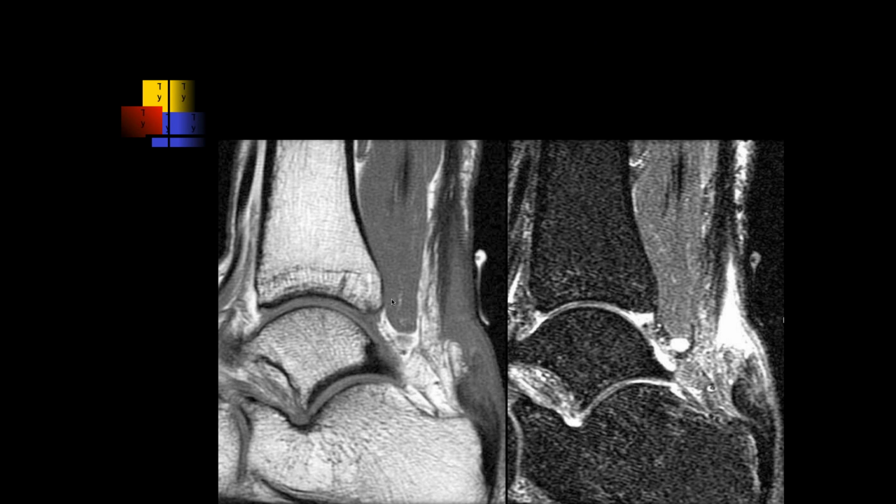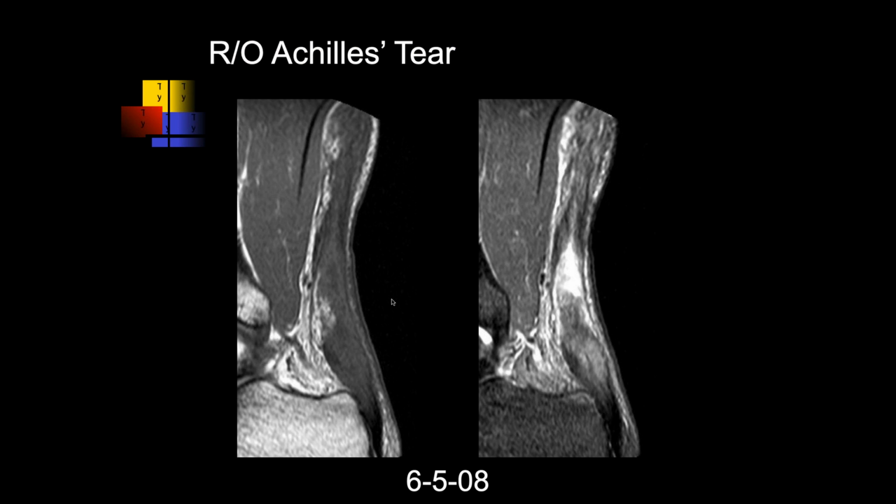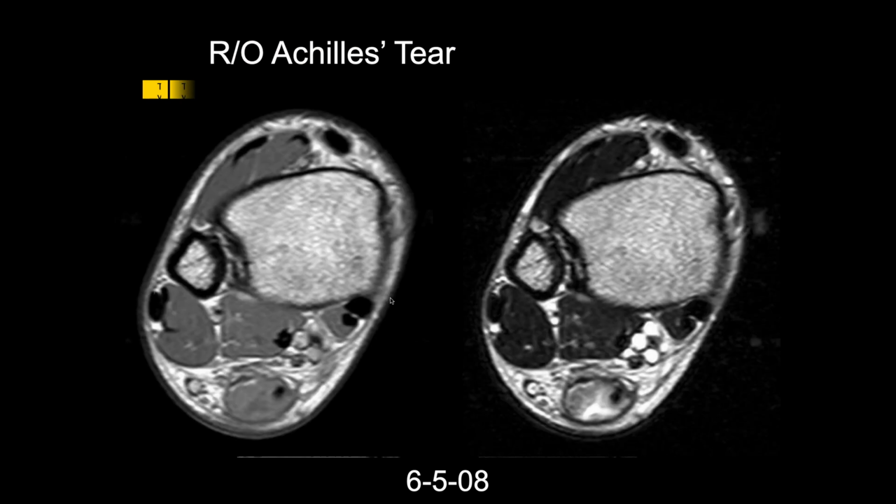Okay, so this looks like a full thickness tear of the mid Achilles tendon. And you can see some laxity down inferiorly. Okay, Ashu, they wanted to know if the patient had an Achilles tear. Yes, they do. Looks pretty complete, pretty tendinotic, a lot of fluid there.